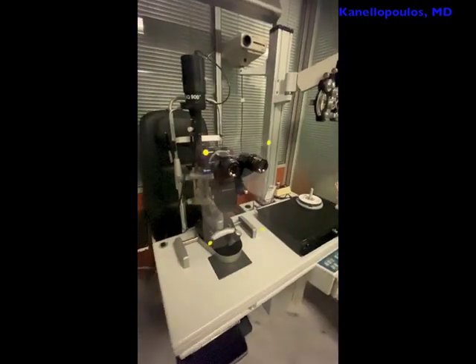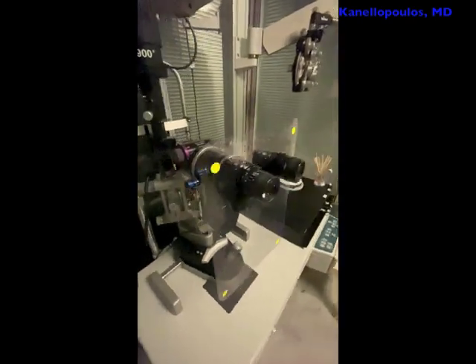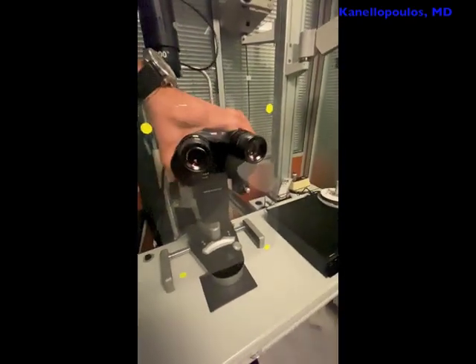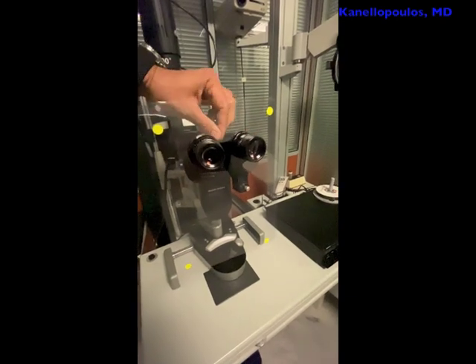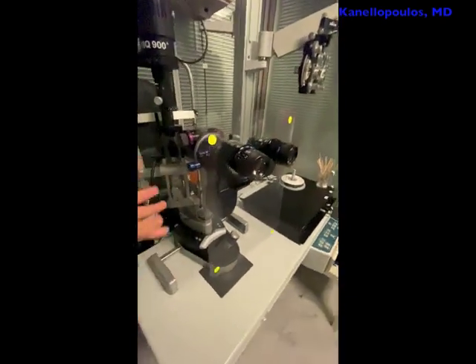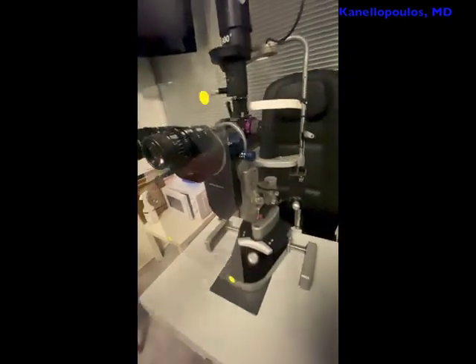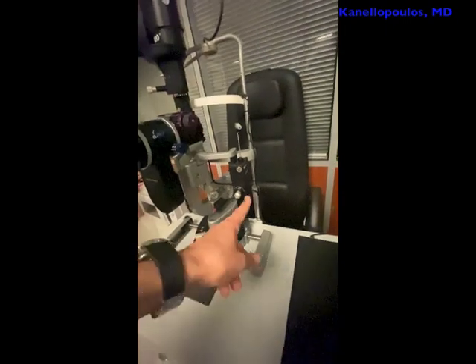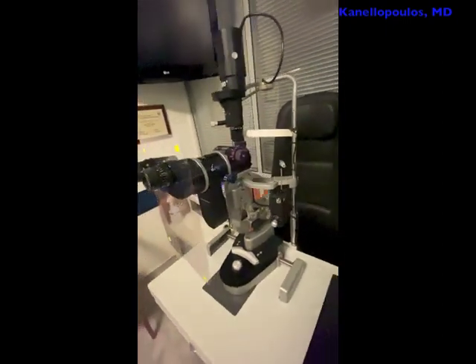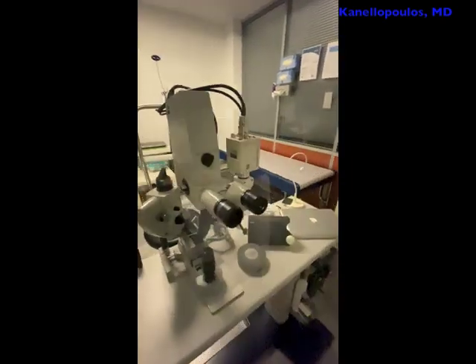Exact same scenario here with our Hextrite slit lamp. You can see how well and how flexible it is in changing the pupillary distance, and how it shields all the functions that the clinician may do — even tonometry, adjusting the Goldmann applanator. This is, as I mentioned, the Hextrite slit lamp. Same thing here with our Visualas laser.